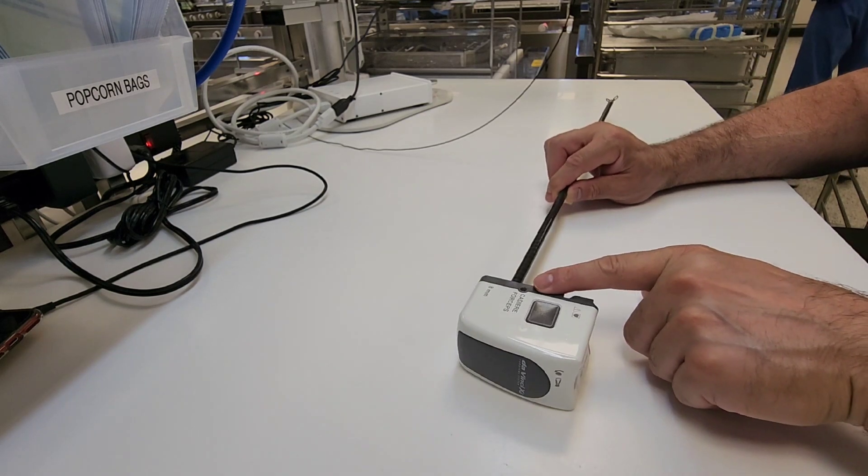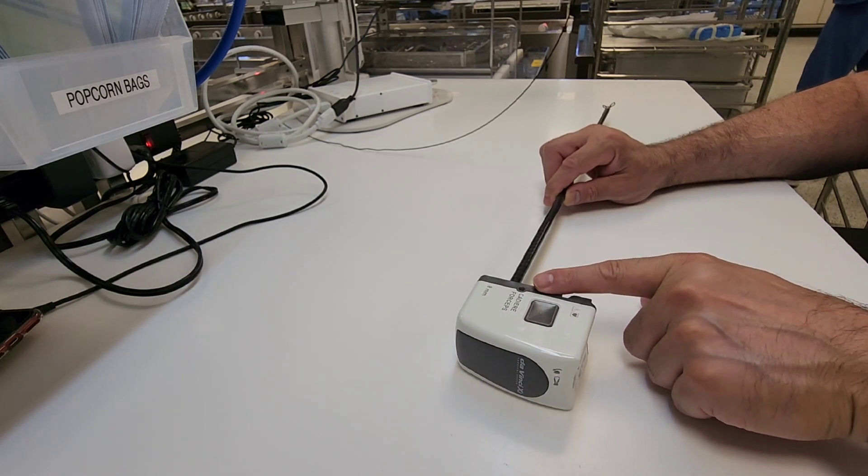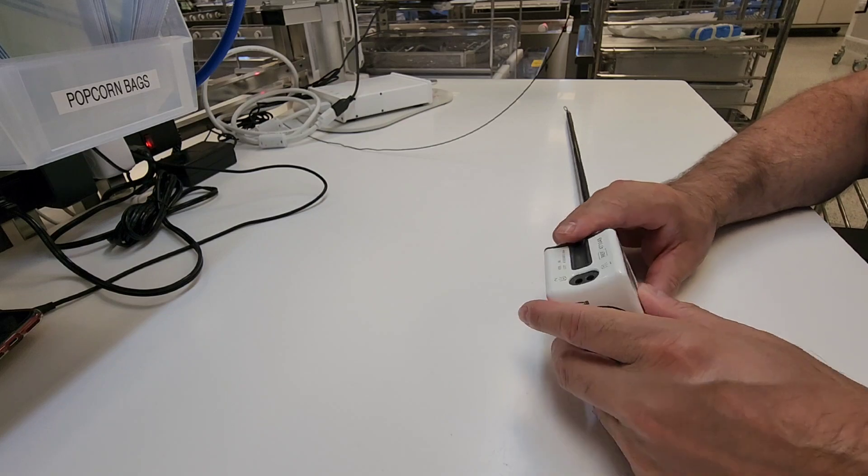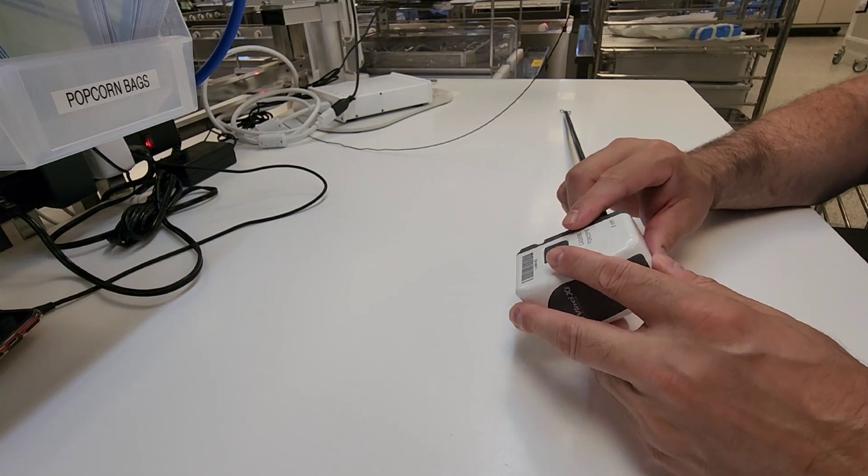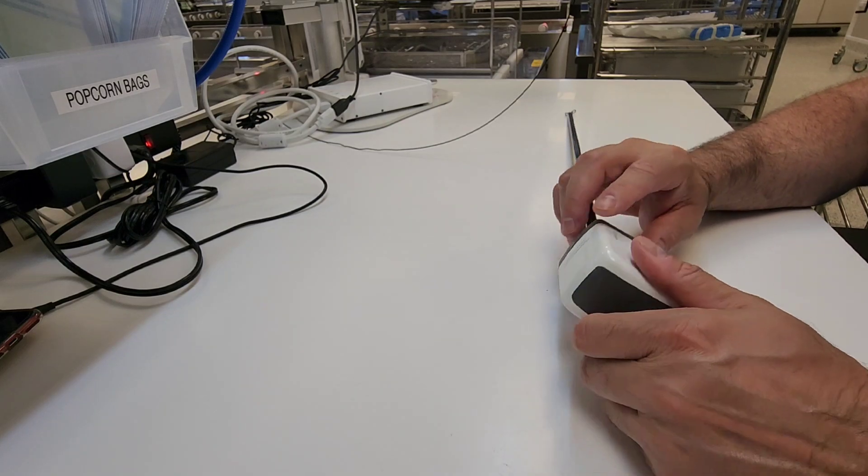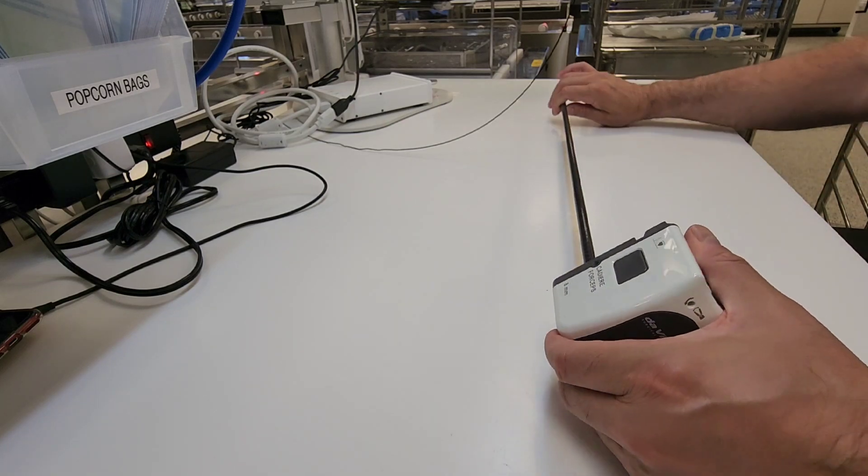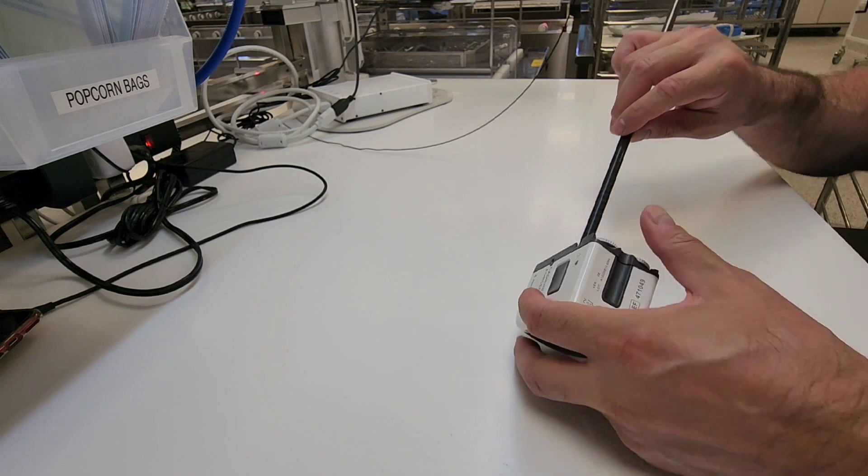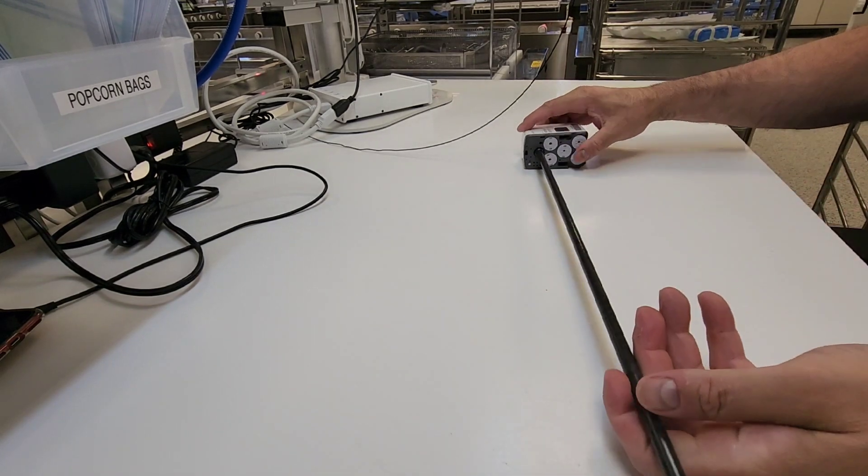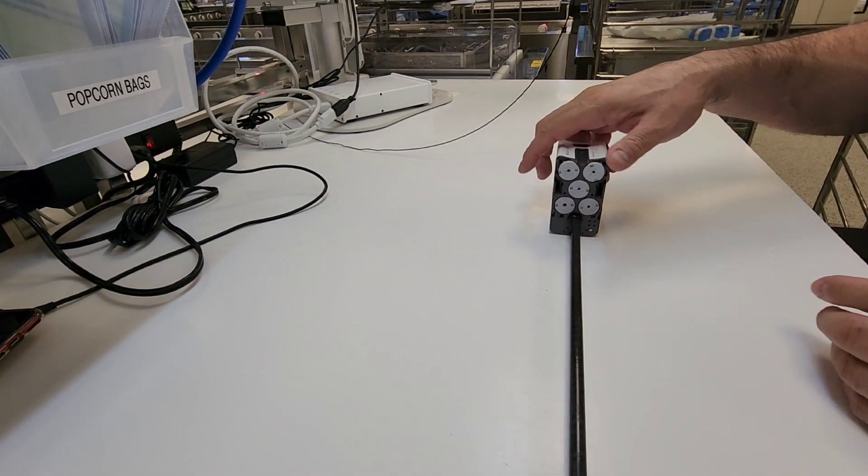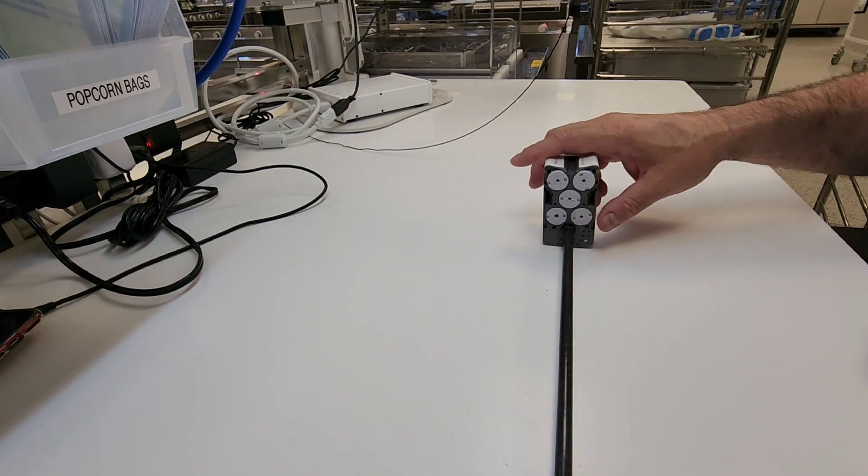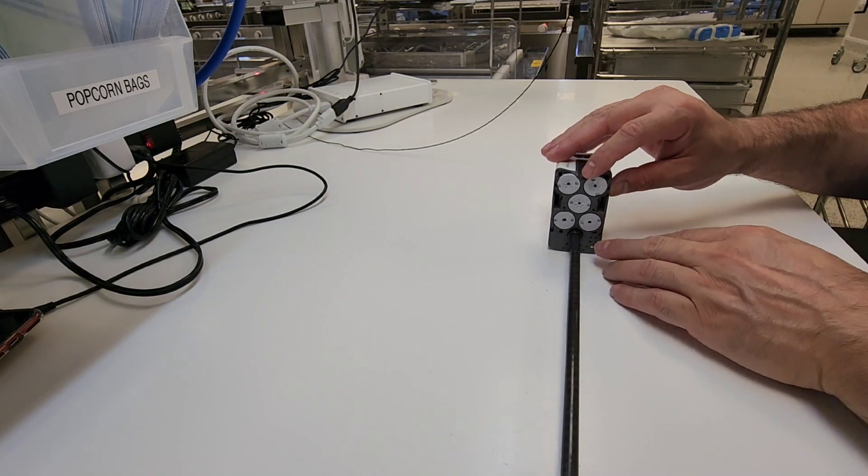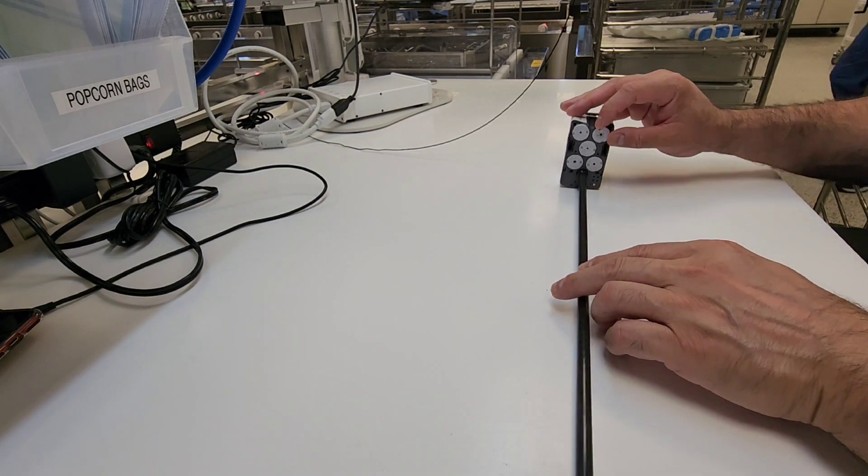First things first, you want to inspect this instrumentation for any damage and check to make sure that it's not over the usage limit, because this has a use limitation and a process limitation.